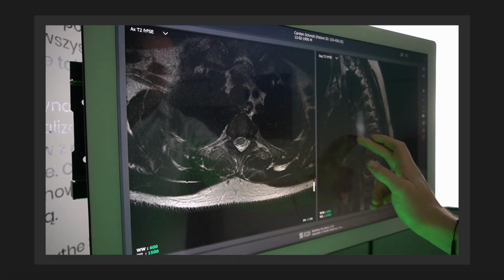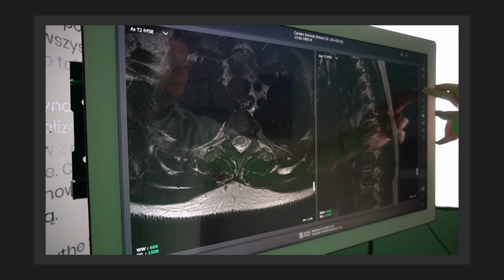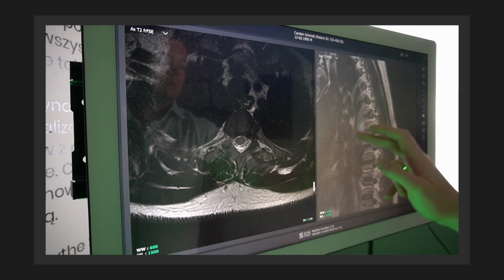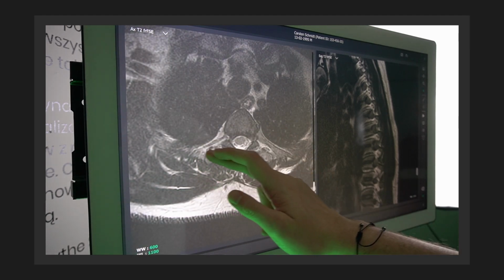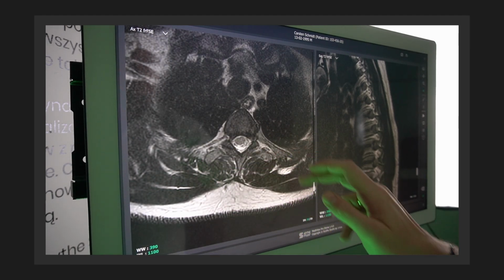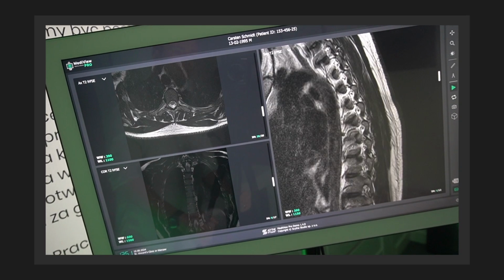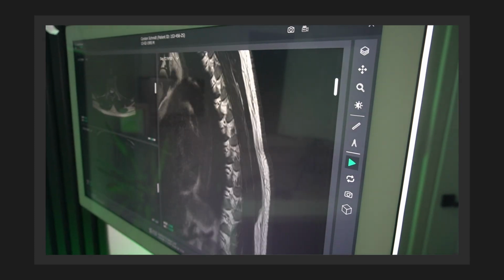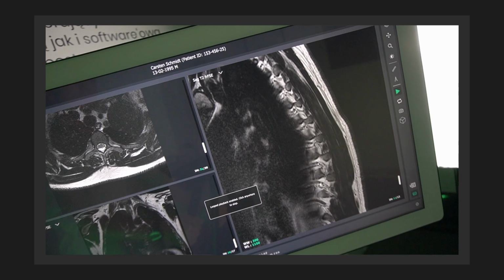So here I have our demo of DICOM viewer application. The medical staff often have to take a look at computer tomography or magnetic resonance scans to see what is happening with the patient. They use it in many cases, starting from dental to spinal or oncological surgeries. Such apps are used very often and extensively and should allow easy integration with other apps and systems to import or export data, even if it's on the same computer. So that's why for this demo we used Windows.